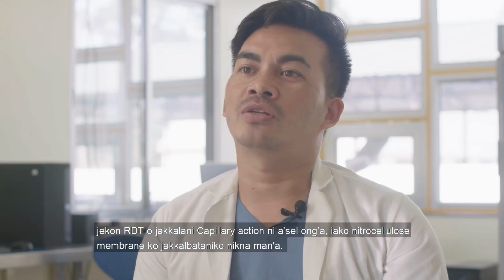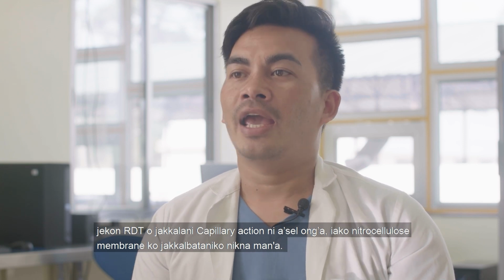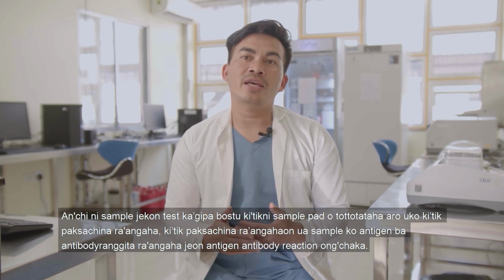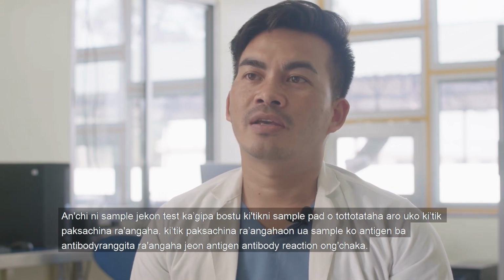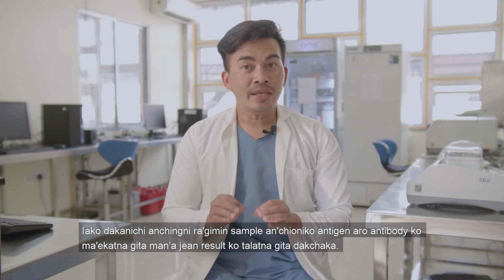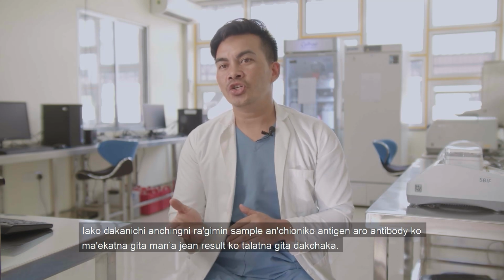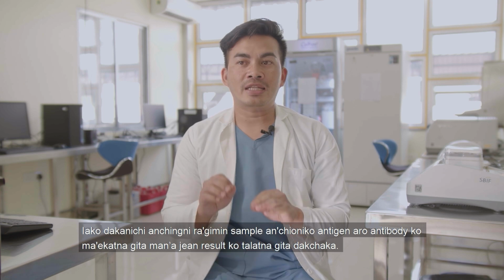Due to the capillary action of the material used in the RDTs, which is most commonly a nitrocellulose membrane, the liquid sample, which is dropped into the sample pad at one end of the device, is carried to the other end of the device and made to pass over the immobilized antigens or antibodies, wherein the specific antigen-antibody reaction takes place. This leads to the separation of the specific target analyte, that is either antigen or antibody, from the patient's blood, which will help in the interpretation of the test result.